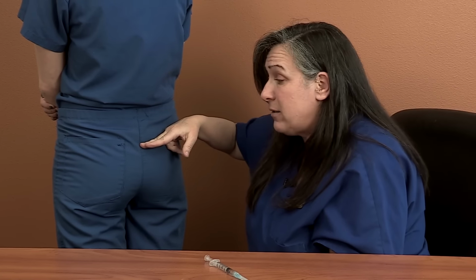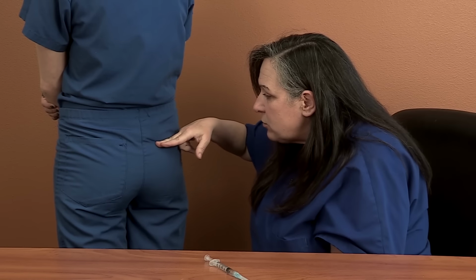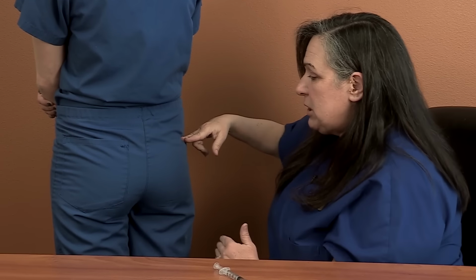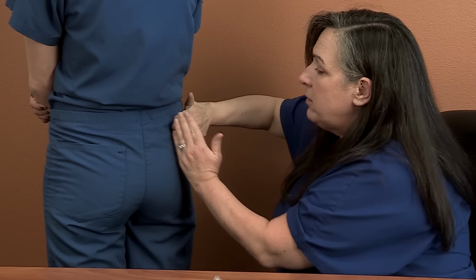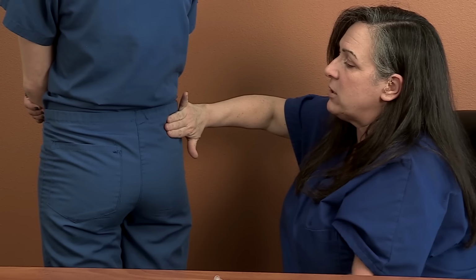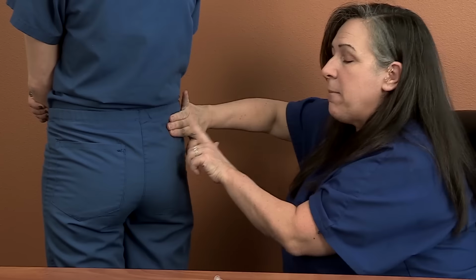Here are your 2 parameters for this injection. Number 1, I want you to stay above the top of the butt crack. So wherever we see that little butt crack, draw a little imaginary line here. Parameter number 2, I want you to stay in the outer half of the cheek. So we're just splitting the cheek in half, which means we're really just about there where my fingers are, right about in that spot there.